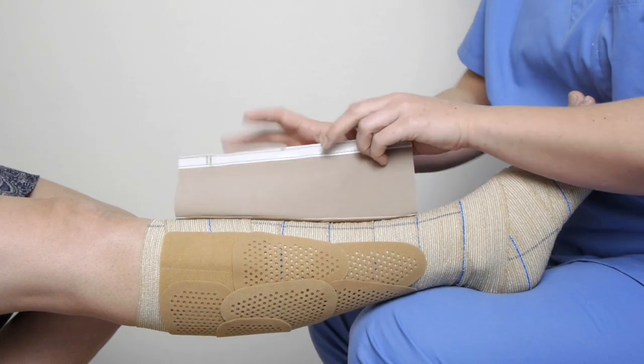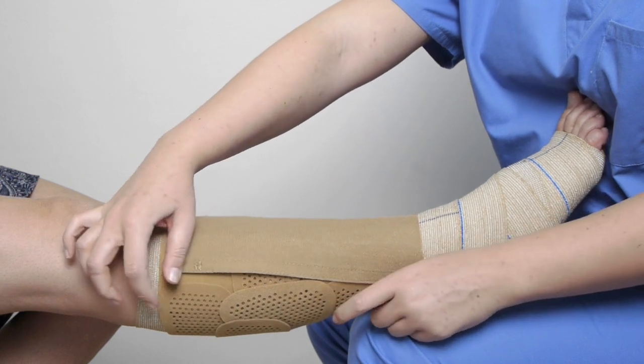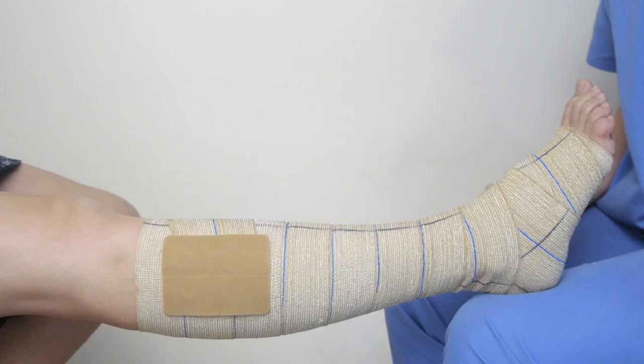After edema reduction, open the fixed patch to easily adjust the size and keep the working pressure. Always apply the press patch with the leg in a resting position.